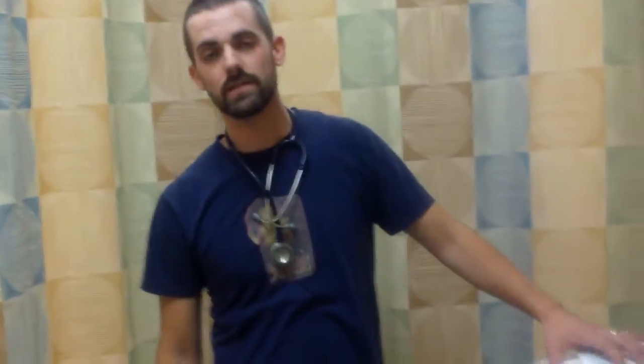I'll go ahead and gather my supplies. I'm going to check my supplies for the expiration date, make sure the integrity of the packaging is good and that everything's intact, and gather all my supplies and an extra pair of sterile gloves just in case. And then I'm going to go to my patient's room.